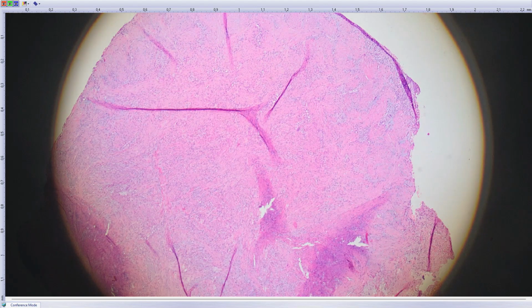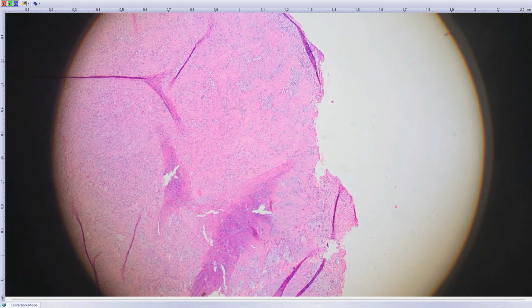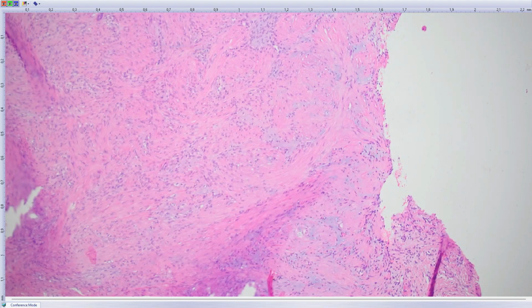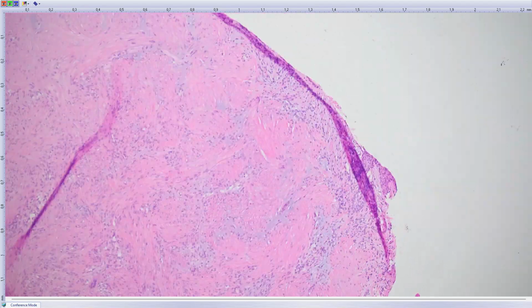So next case, this was a very interesting one. It's basically a newborn girl, born in the summer of last year, and she has multiple cutaneous lesions, which usually are a few millimeters up to 1 centimeter in size. And we got biopsy from 2 of these lesions. Both look identical.